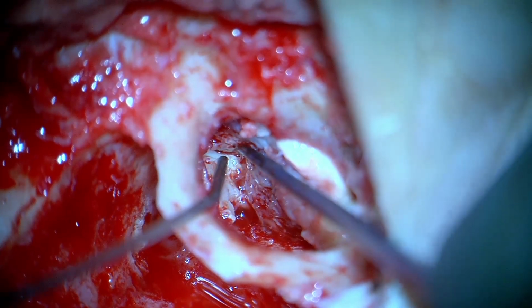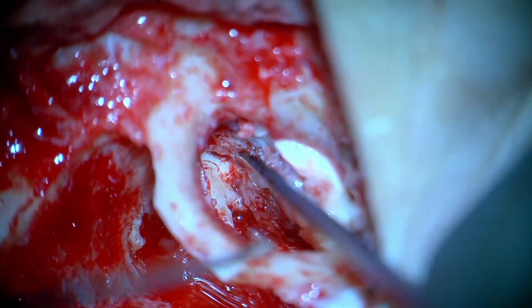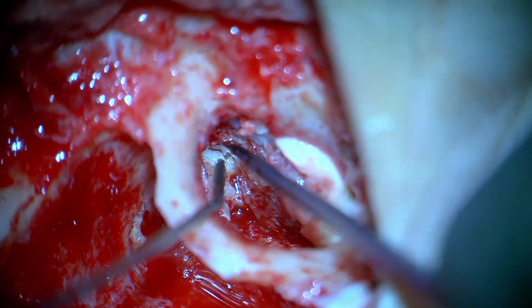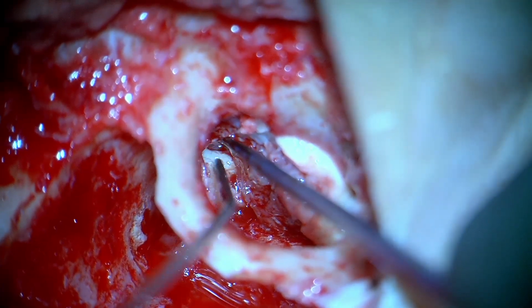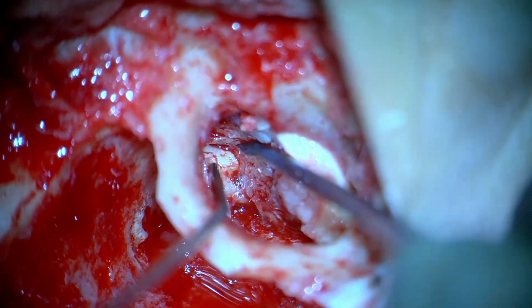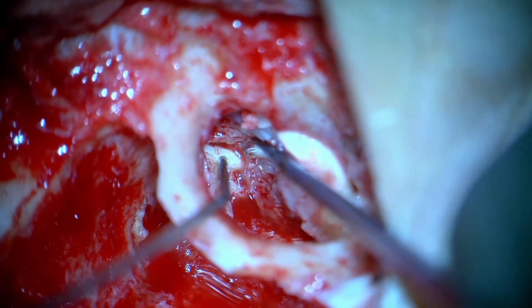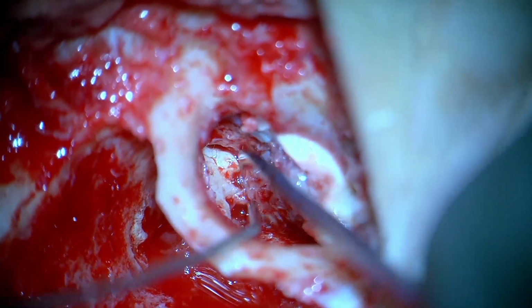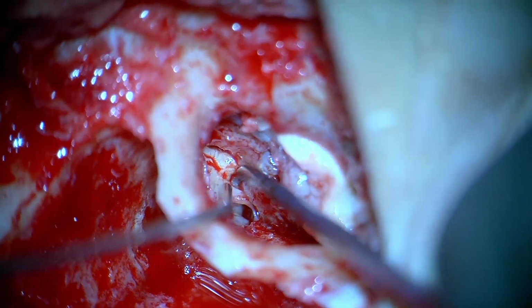And you see now, with a mixture of instruments from iris scissors to a sickle knife, we keep on dissecting the disease and the epithelium, or not the epithelium in this case actually, the granulations and the sort of unhealthy mucosa from the incus and some portion of the malleus as well, because you want to remove every bit of infected tissue that has been discharging for quite some time to optimize the surgical outcomes.